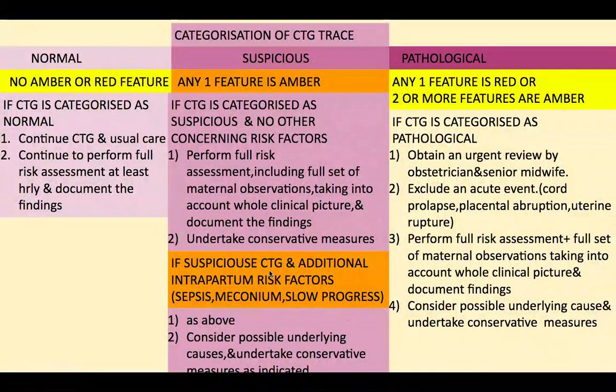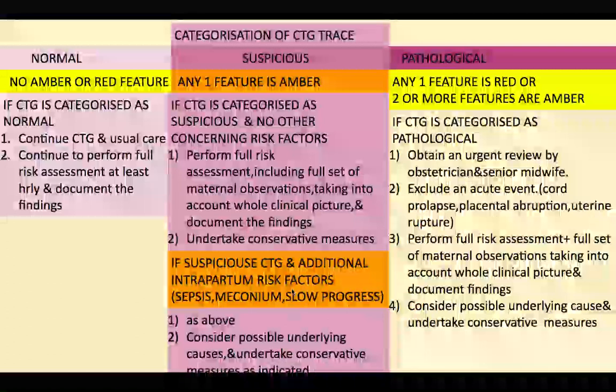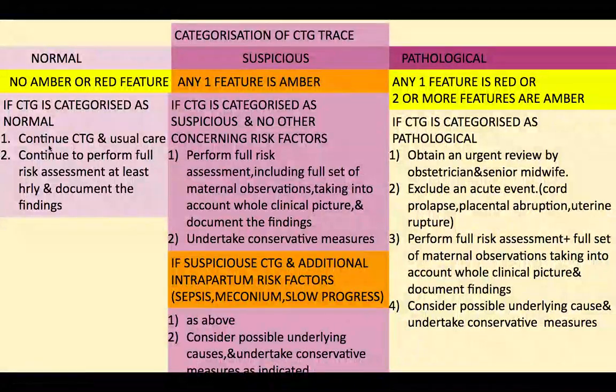Now, if the suspicious CTG and additional risk factors are present, what we have to do, we will discuss that in detail as well. It is coming in the next slide. This is one scenario. This is the second scenario. This is a third scenario. This is separate, don't confuse it with the upper one. These are not the same. These are two different things.